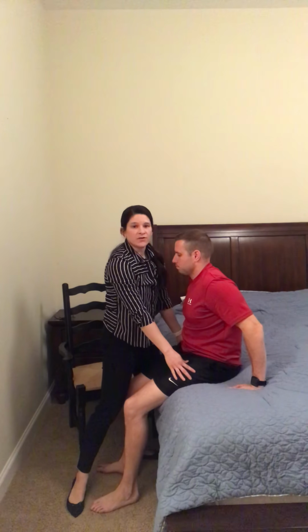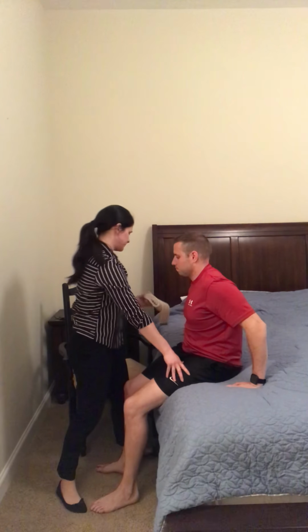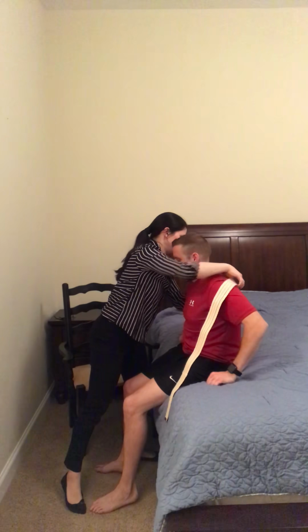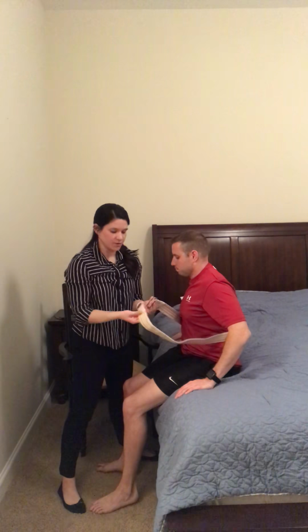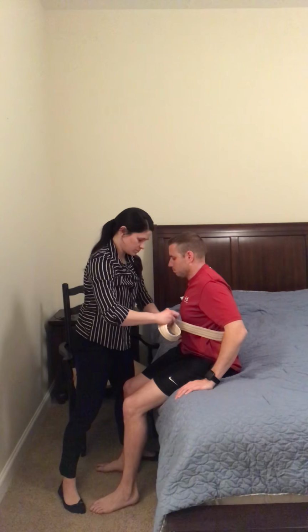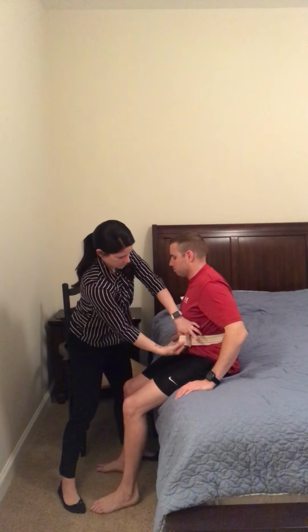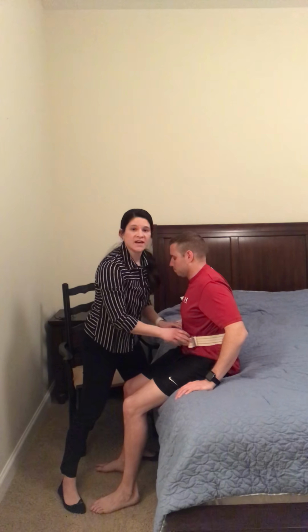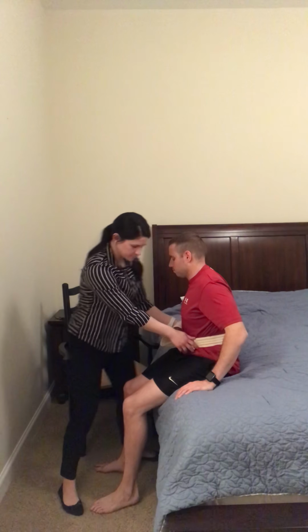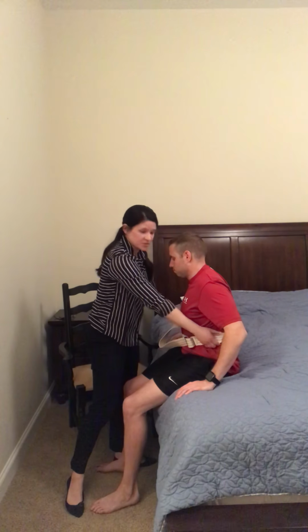Once the person's feet are flat on the floor and they are stabilized on the bed, now we need to put on the gait belt. To put on a gait belt, you'll put it around the client and then use the locking mechanism so that you can tighten it around them. You'll want to tighten it until you can fit only about 2 or 3 fingers in between the belt and the person. This is to help hold on to whenever you're transferring the person for safety.